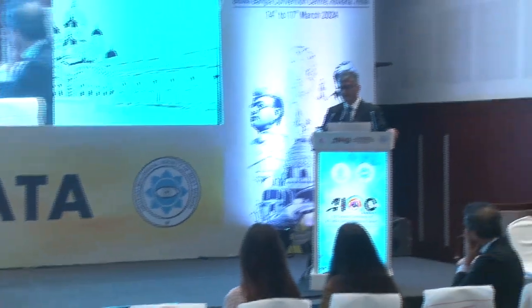So what we can do is that you can either intraoperatively perform some of the procedures, or post-operatively you can do the refractive correction once you have the outcome of your cataract surgery. I think here I see a definite role of light-adjustable intraocular lenses, and once these become commercially available, they are going to be of great help. Currently, one of the investigators in India is working on developing these lenses, and I'm sure that probably in 2025 we will have those lenses available.